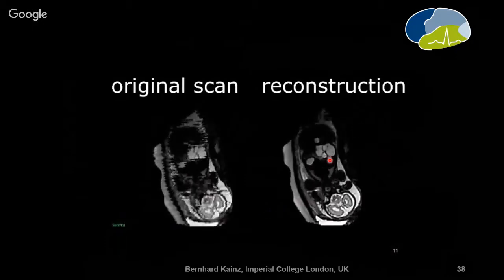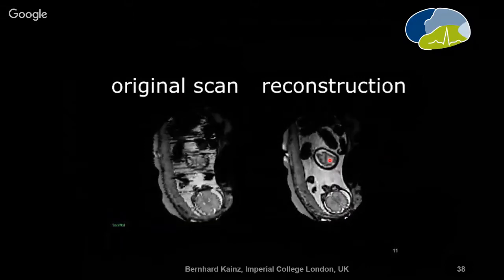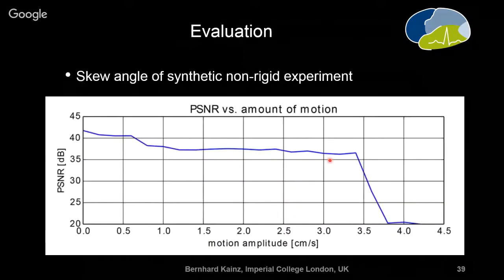So I have 2 minutes left. I will spare you the boring data. So of course this stuff breaks down at some point. This will break down around 4 centimeters motion amplitude. So if the fetus moves more than 4 centimeters consistently over the whole sequence, we cannot reconstruct, but before that we are actually quite good. We are reconstructing quite well.